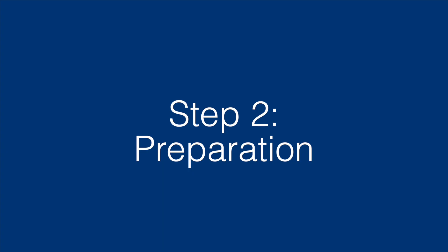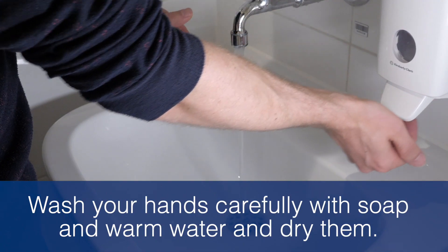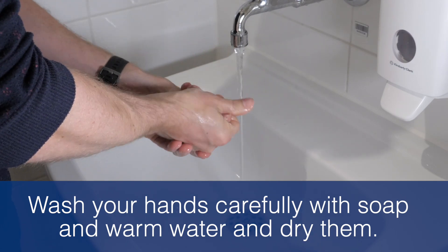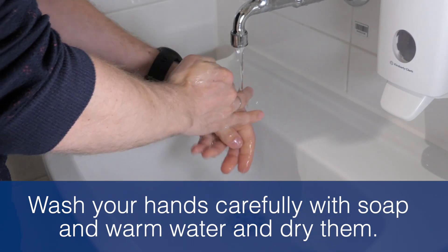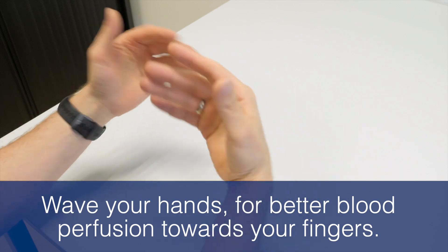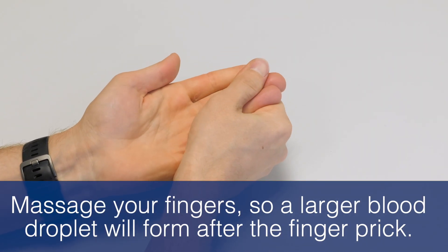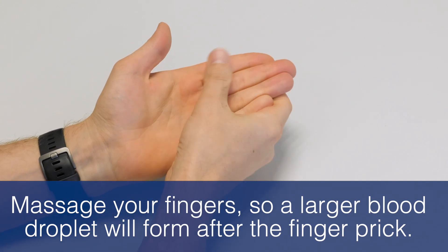Step 2: Preparation. Wash your hands carefully with soap and warm water. Warm water helps to open up your veins. Wave your hands for better blood perfusion towards your fingers. Massage your fingers so a larger blood drop will form after the finger prick.